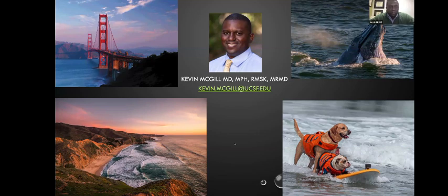But I also talk to the surgeons and look at the history. If there's no history of injury there, and no pain, no markers, then it'll be a little different. But if we're just talking about grade 1 injuries, usually if there's any signal, we'll call it a grade 1 injury.